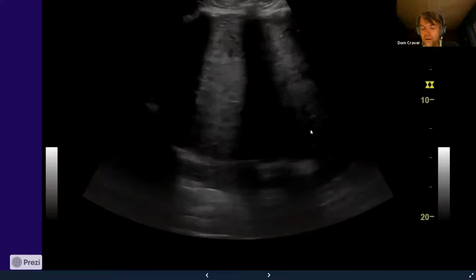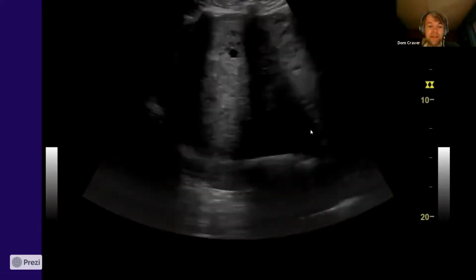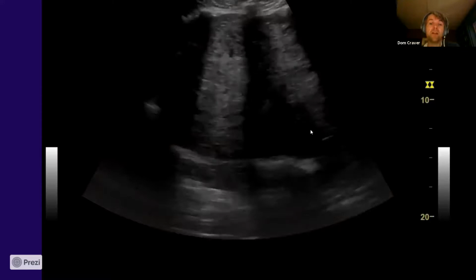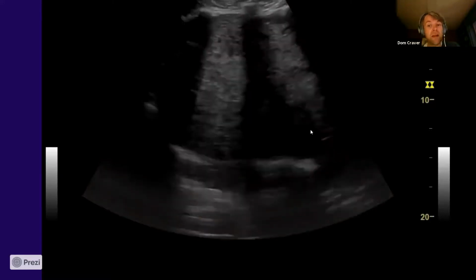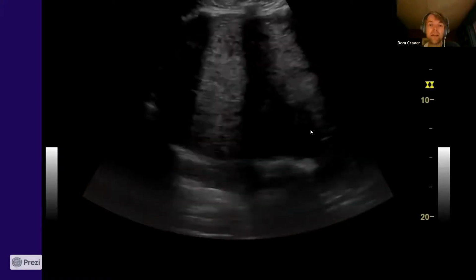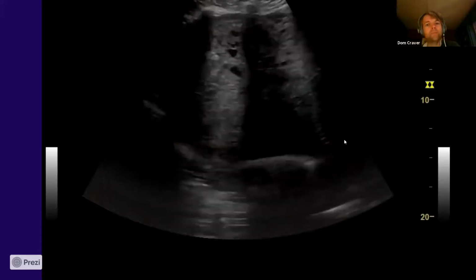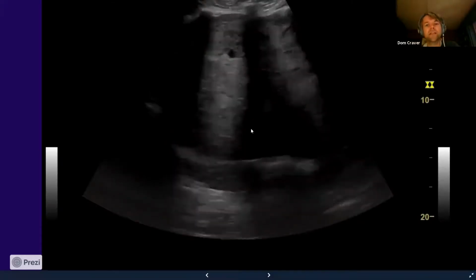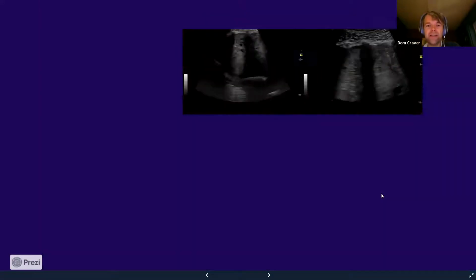We're very privileged where I work because we do have paediatric radiologists. But this kid was sick. He was sat on the edge of the bed. He could not lie flat. And the story transpires that he's had intermittent chest pain for the past 6 months and getting a bit more breathless over the past few weeks or so. But had no B symptoms, nothing else to make us think lymphoma. But I thought, okay, so if this could be a mass, let us just move the ultrasound around and have a look at his heart.